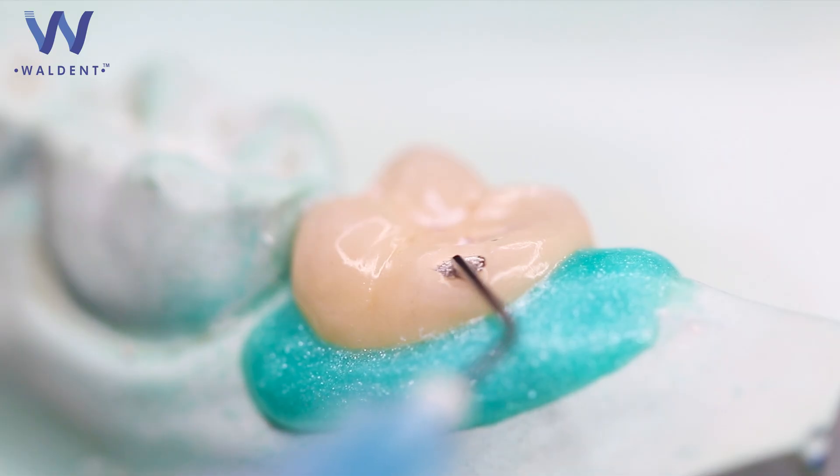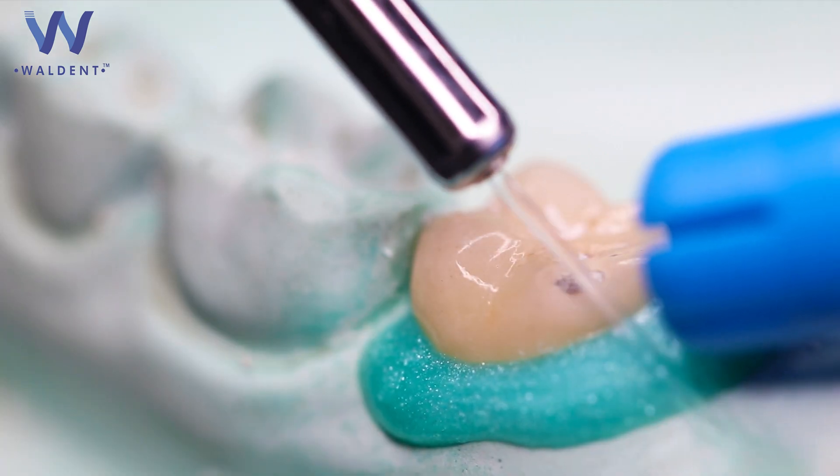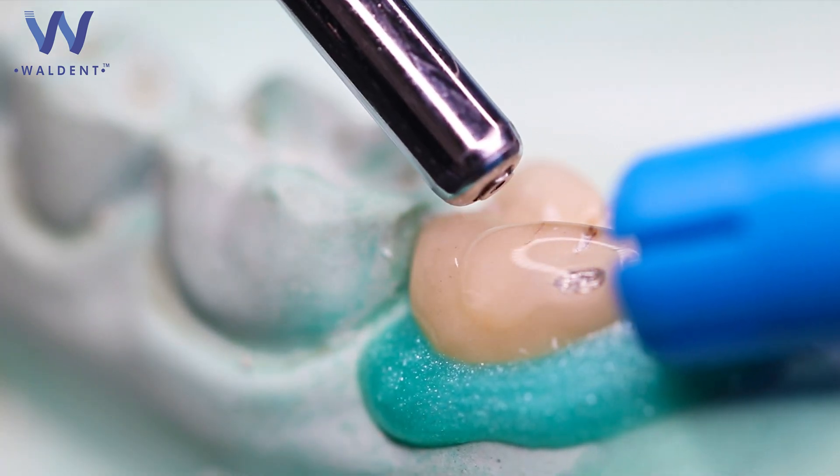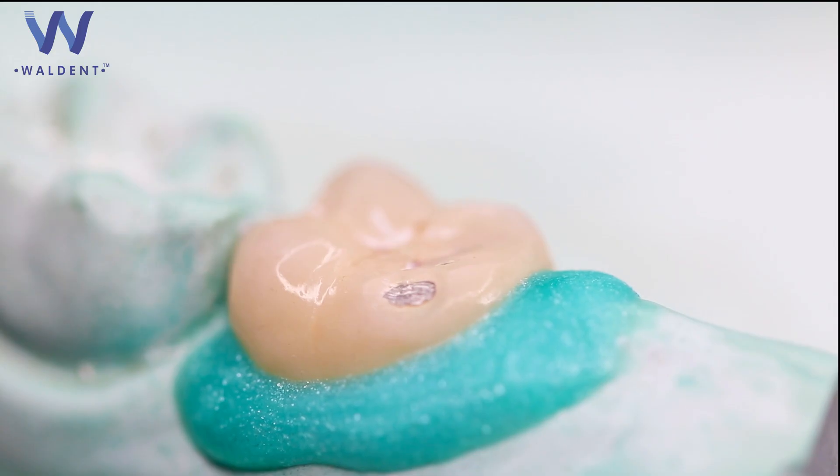Be careful to avoid enamel and dentine. Slowly express an even coat onto the required surface for 90 seconds. Rinse and suction the applied porcelain etch from the surface and dry completely. Etched porcelain should have a frosty appearance. If it does not, then repeat the etching process.